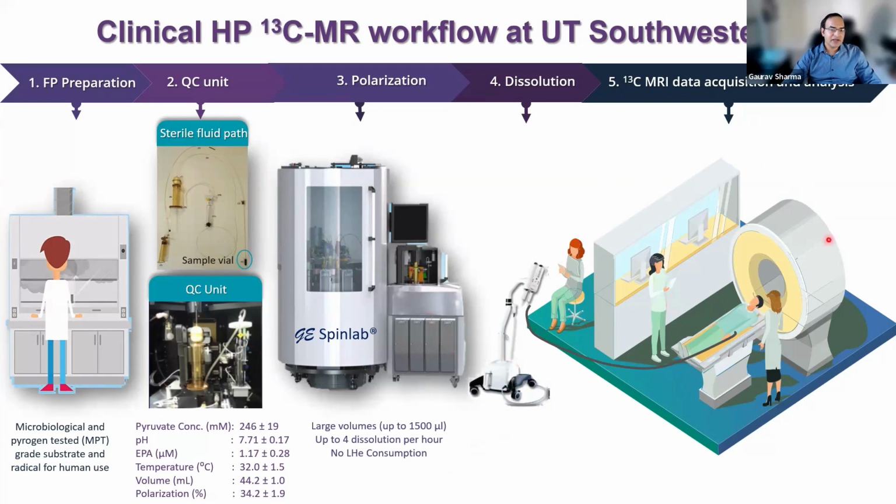This is typically the workflow, and we have a dedicated MR technologist and nurses who recruit the patient and take informed consent. The studies are IRB approved, and after that we scan the patient after injecting the hyperpolarized carbon 13 with the bolus. About 45 seconds after that, we start scanning the patient, and that produces really gorgeous images.